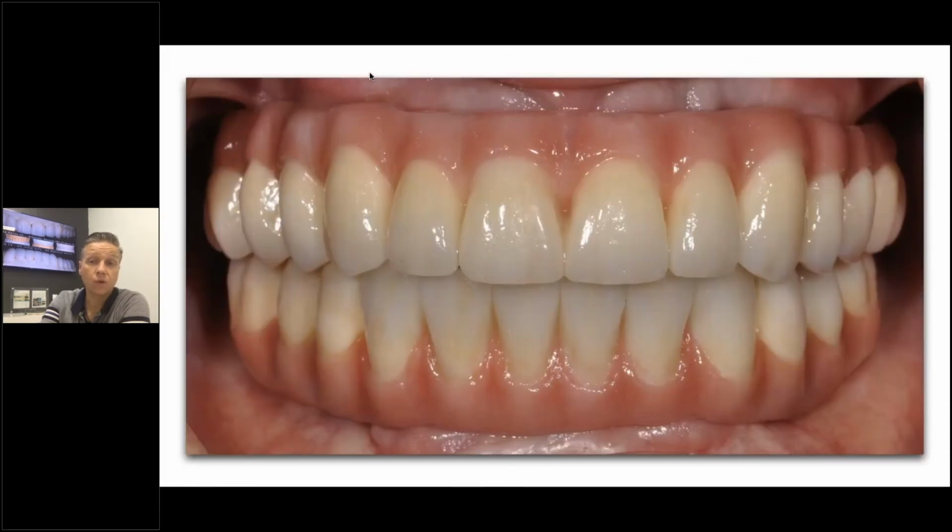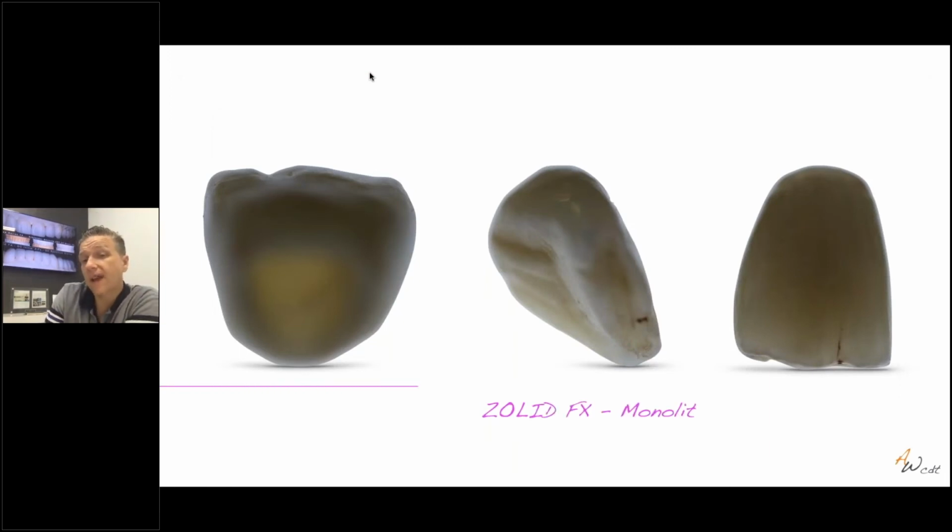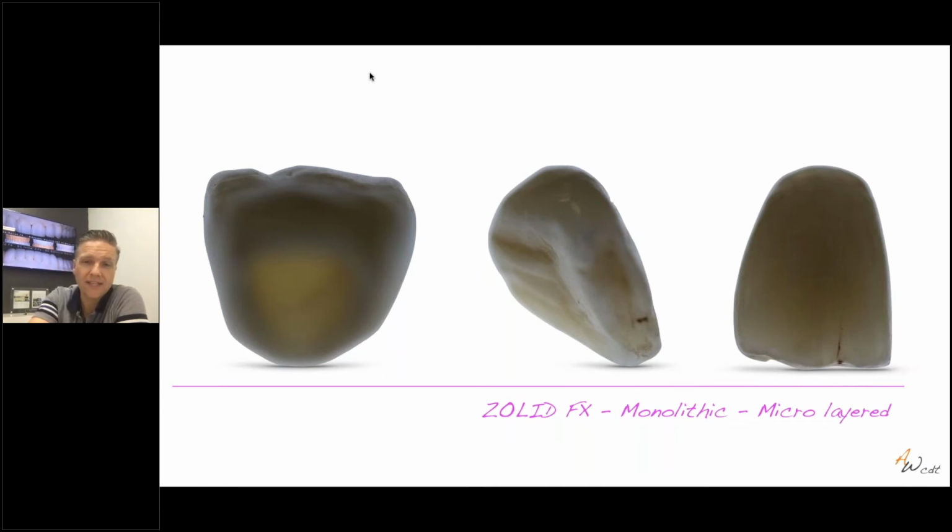The lower here was totally full contour except for the pink. The upper was just layered for the insides, for the anteriors. I want to show here quickly the Zolid FX case, with more translucency. You see the light transmission through the crown, but I also want to show the anatomy, and how important anatomy is when you look at the left side of the left picture, how aggressive that line angle comes out here. That is so important, to really match another tooth, to copy the other side as well as possible.